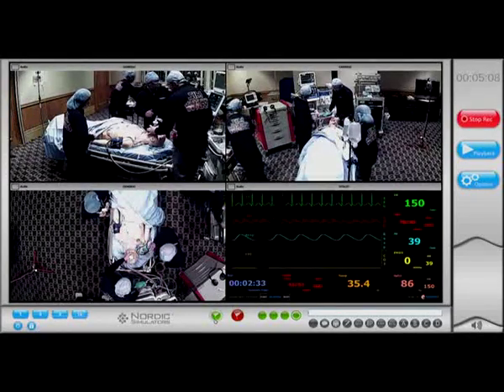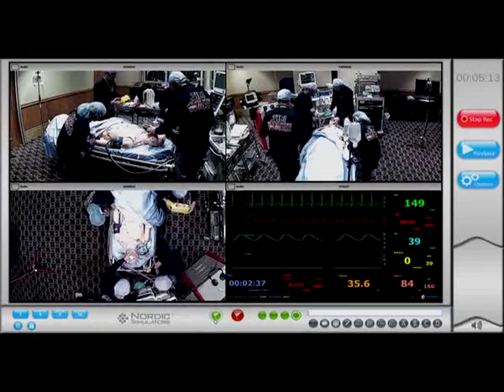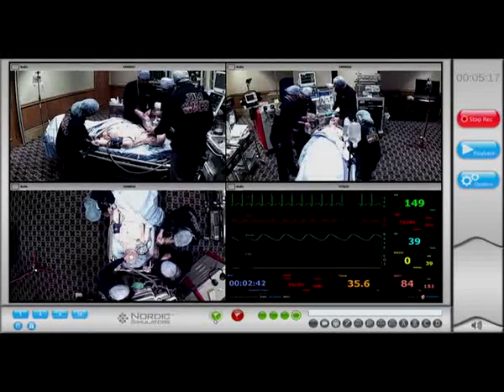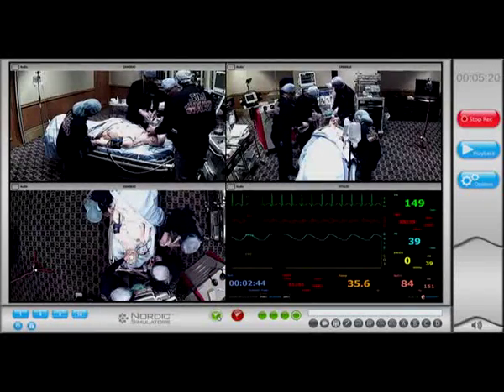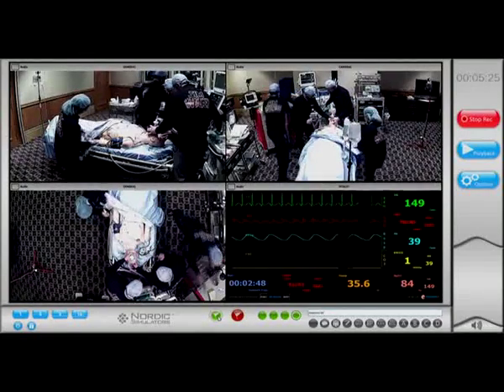In the left side? Yeah, but the saturation is going down. I think we should intubate. Should intubate, please. Tube? Yes, doctor. Okay, go ahead. But do inline immobilization, please. Yes, I'm ready. I need tube 7. We will put this after. Go ahead. Get the tube ready.